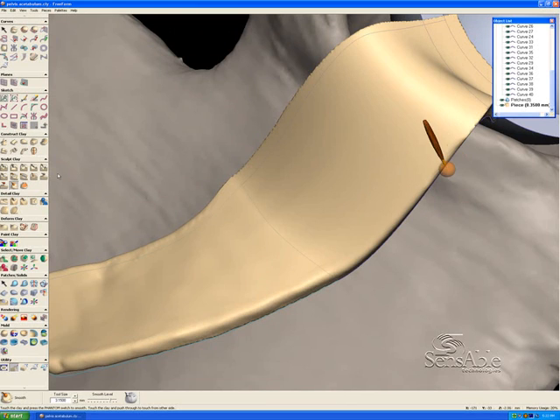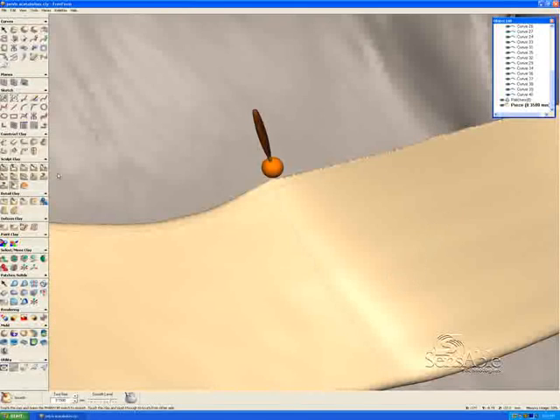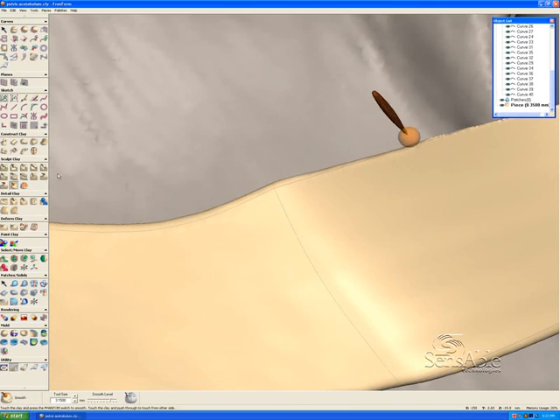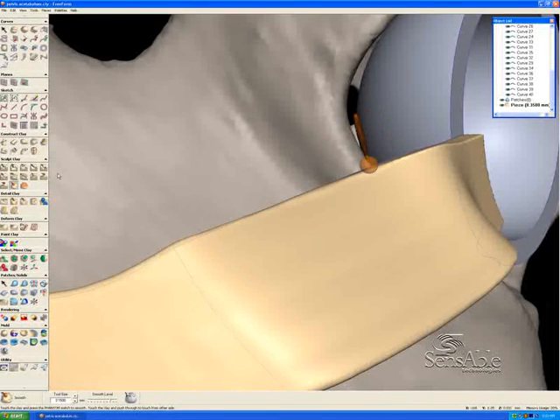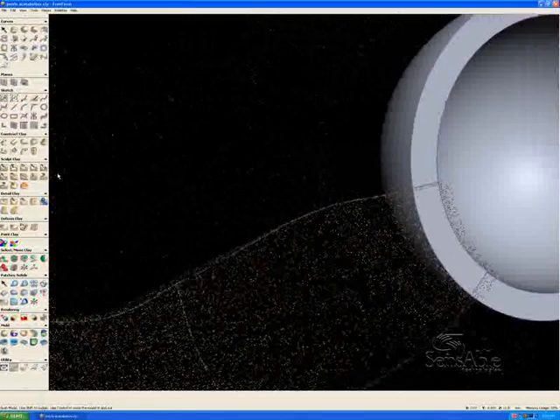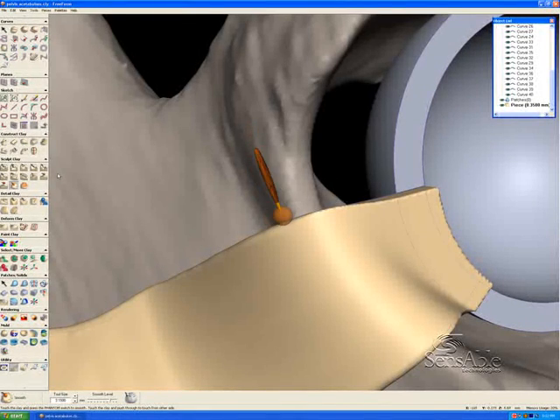In addition to freeform, we can mill or RP a prototype of this implant, or we could actually RP the direct implant itself if we were utilizing something such as SLS technology and printing out in a metal alloy. So here we're simply smoothing out all these edges and getting it to be as doughy as possible so it's friendly on the inside of the body.